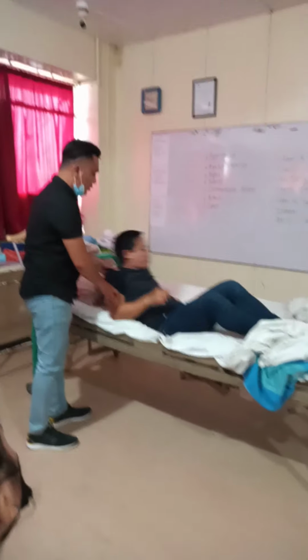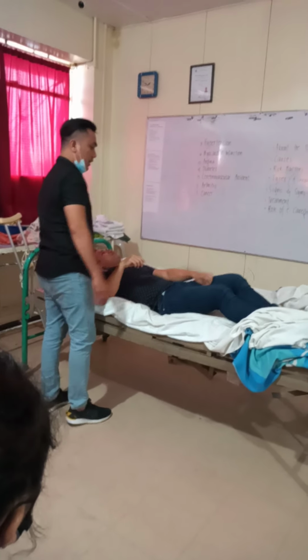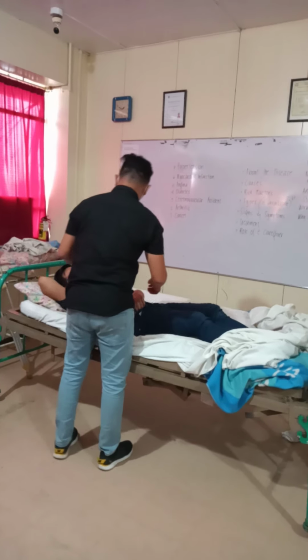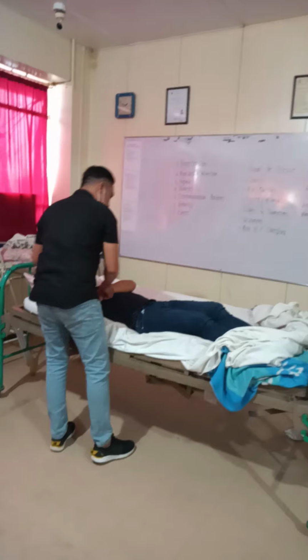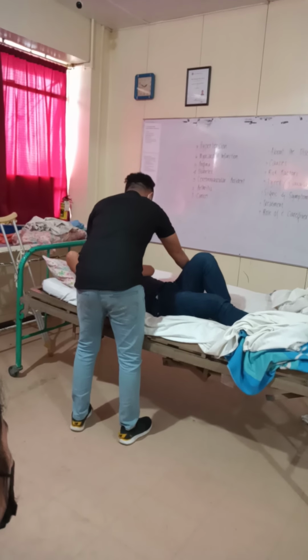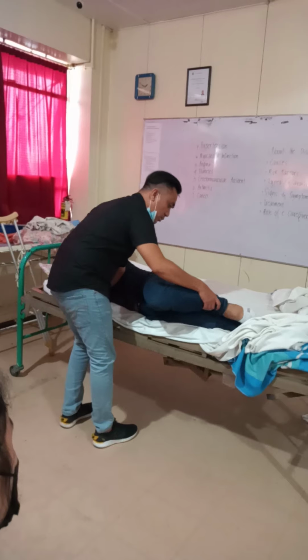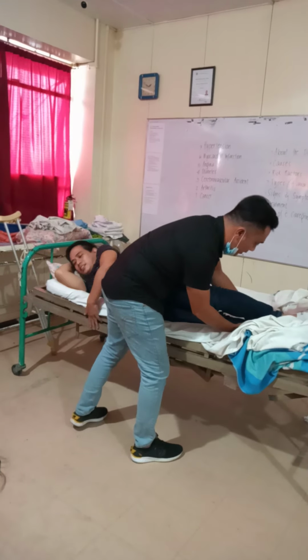Once the patient is on the side, we will prepare the patient. First, let's put the patient in the side-lying position, facing the edge. Count of 3, sir, turn to the side. 1, 2, 3. Turn. Okay. So once the patient has turned to the side, ask them to look straight ahead.